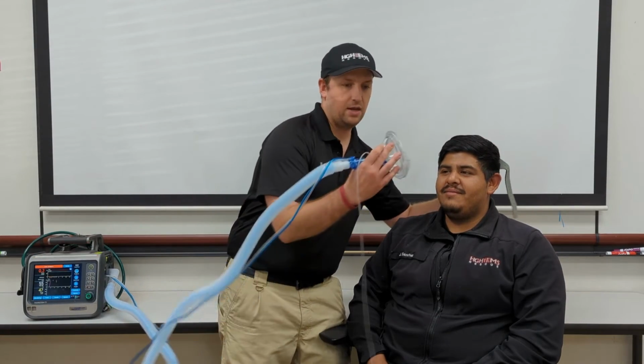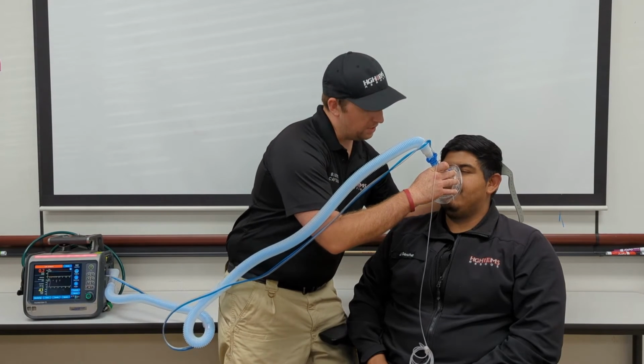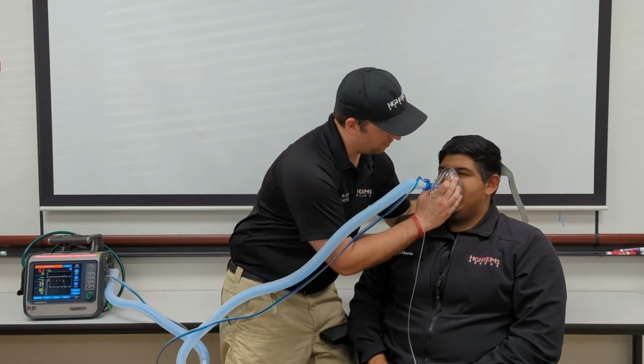BiPAP mask application. One hand, head strap, other hand the mask. Then start the ventilator. Back of the head, mask, bridge the nose, make sure you encompass the entire mouth.